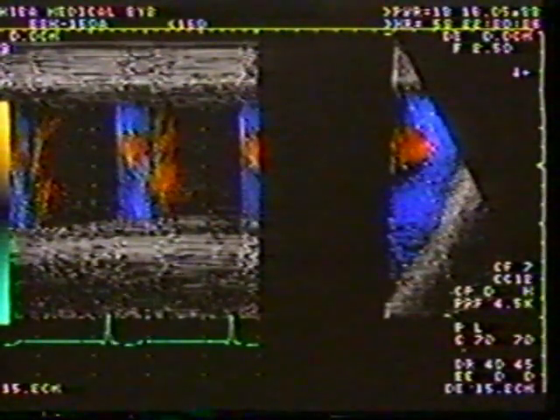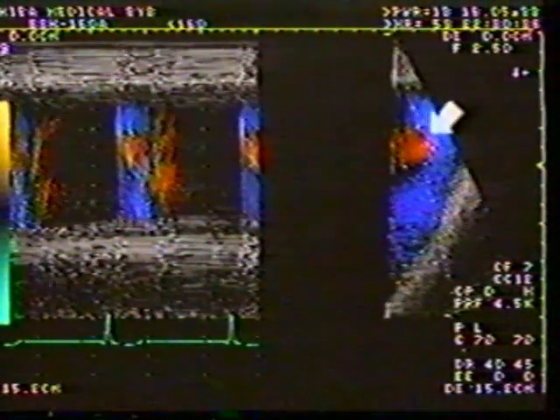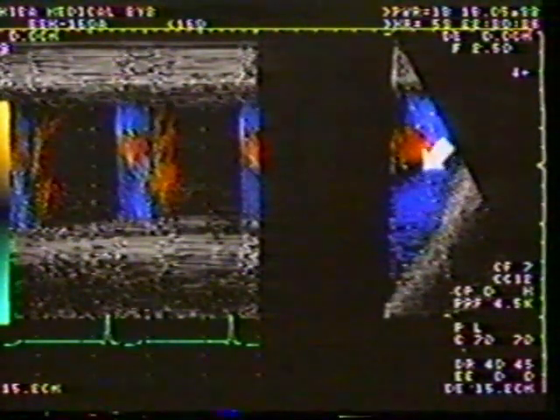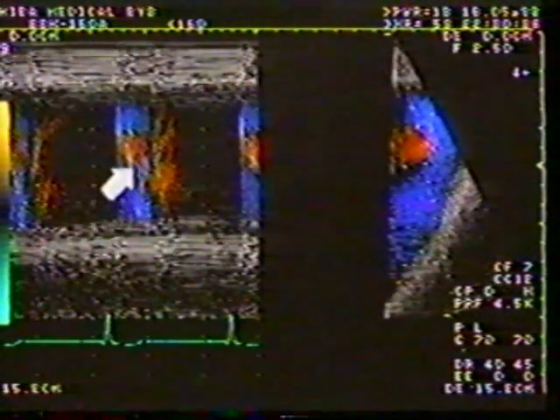This 61-year-old female has moderate aortic regurgitation. In systole, flow in the descending aorta is largely encoded in blue. This red area is due to color alias. These same findings are noted in systole on the color M mode. Flow reversal is noted in diastole. Rather than being a very brief color event, the flow reversal in this patient lasts for about 1/4 of diastole.